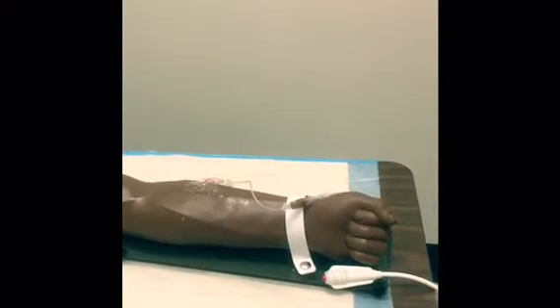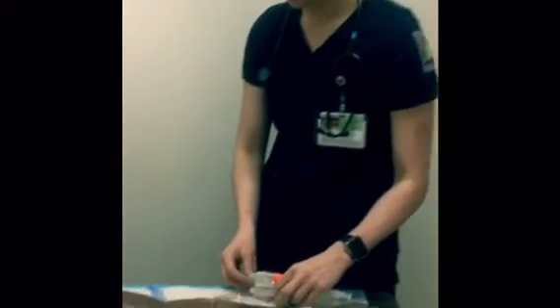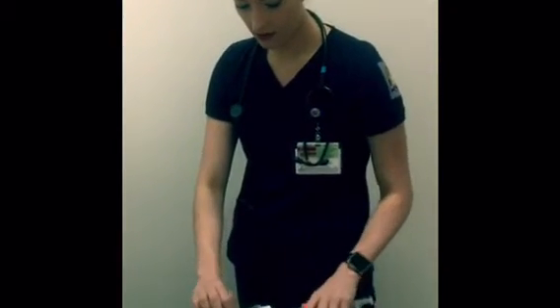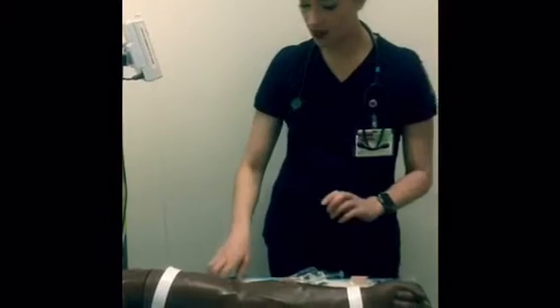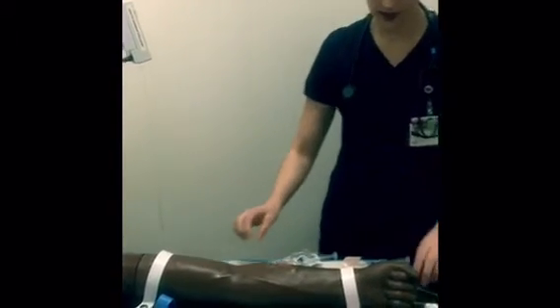Okay. All right. Before we put this medication in, I gotta verify, do you have any allergies that you're aware of? No. All right, so that is good. We can continue as planned. Right. So I've washed my hands. I have all my supplies here. You get those set down. I'm gonna stop your pump that's running right now. You get that stopped and clamped off. All right. So that's shut right now.